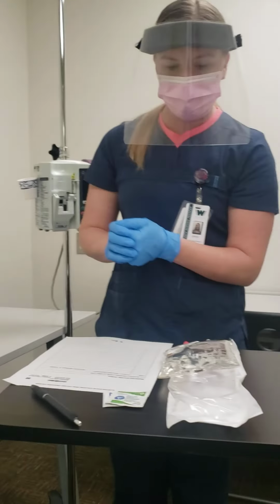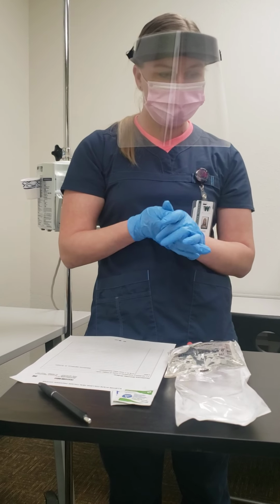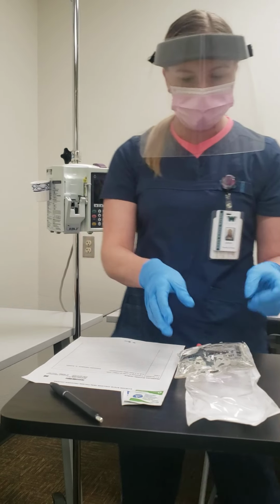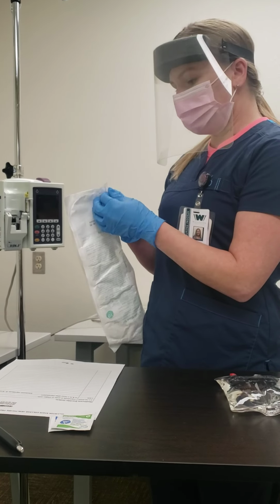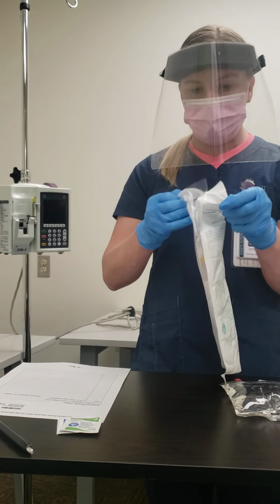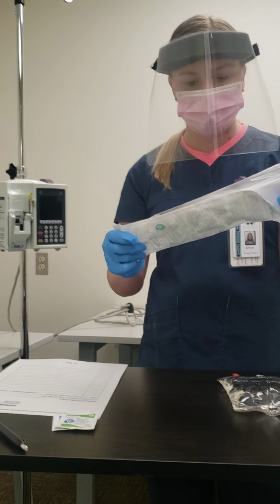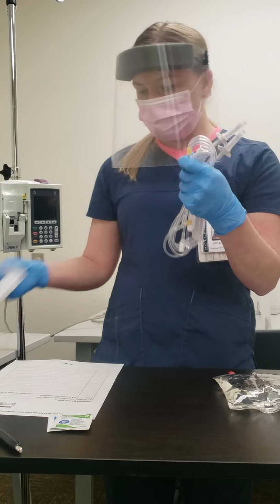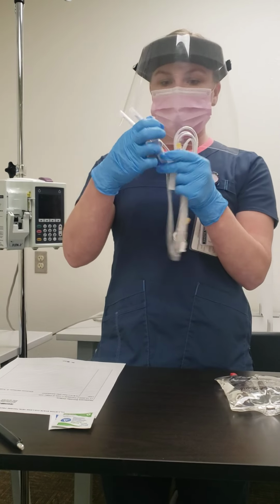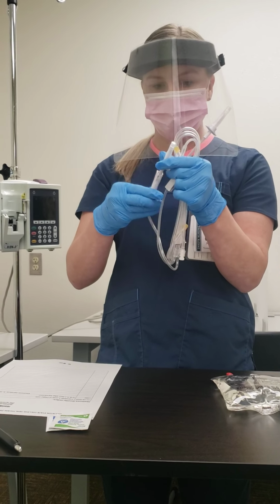Okay, and so now I'm just going to go ahead and do my normal saline, just to go ahead and have that ready for the blood administration. So I know I need a 250 ml bag of normal saline because it's the only one that's compatible with the blood. Okay, just going to make sure that all my clamps are closed to start.